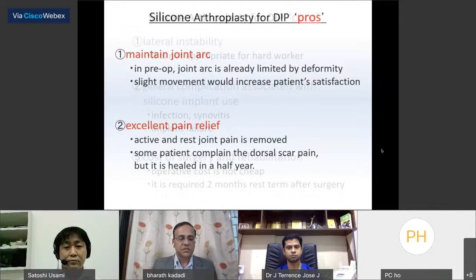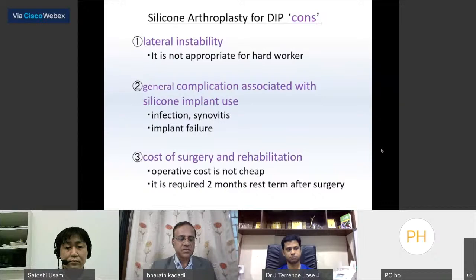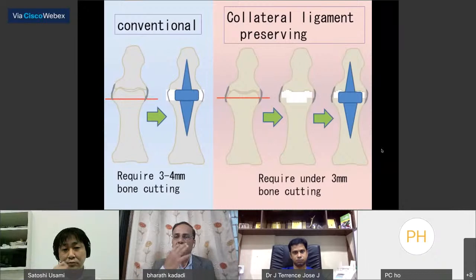The most serious problem of DIP silicone joint arthroplasty is postoperative lateral instability, and this procedure is not appropriate for hard workers. For resolving this problem, recently I insert the hinge of the silicone implant into the medullary canal, preserving the lateral cortex of the middle phalanx and attached lateral band. This is a simple schema of our tip of silicone insertion for DIP arthroplasty to preserve the collateral ligament. But there is a problem of implant subsidence in long-term follow-up. I think additional follow-up would be required.